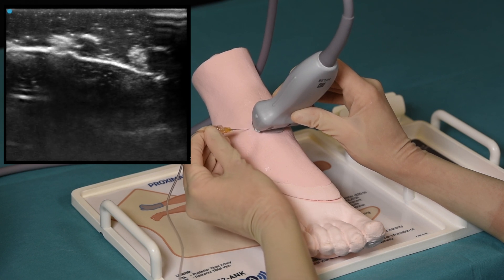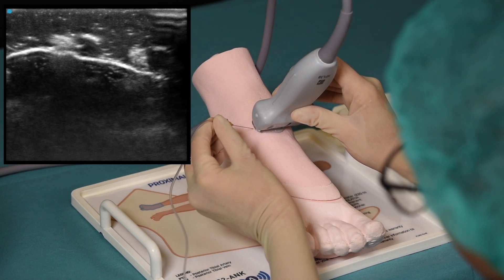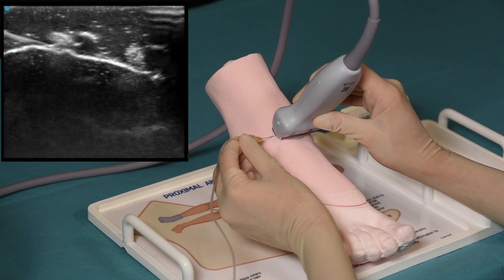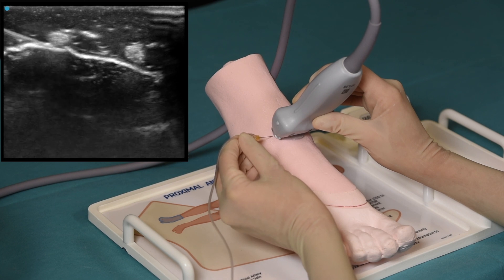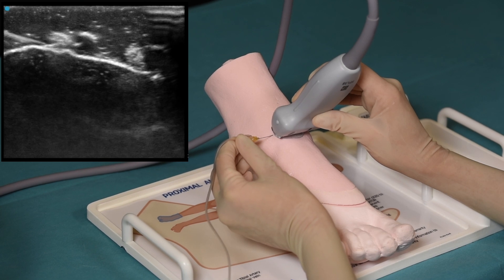This video only shows the approach to the deep peroneal nerve. However, the ankle block Nysora simulator can be used to practice the injection techniques and blocks of all five nerves involved in the innervation of the ankle, which are the tibial nerve, deep peroneal nerve, superficial peroneal nerve, saphenous nerve, and sural nerve.